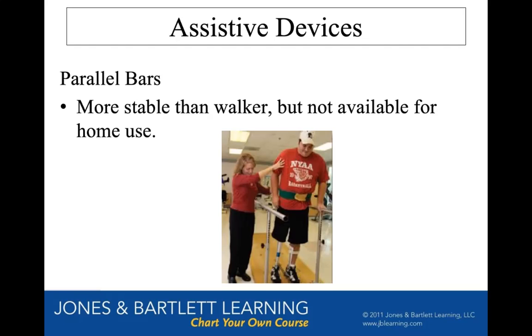But sometimes there's some people where, even if they're young, it just depends on their diagnosis and other comorbidities. You got to take it slow with some people. Amputees, especially, like with this guy, the best place to start off with amputees, in my opinion, and many of the opinions of the amputee gurus out there, is to start in the parallel bars, because you've got to learn a lot of self-awareness of weight shifting and a new center of gravity, and that's a whole new ball game if you go on amputees. Pretty fun though. We'll learn a lot about that later on.